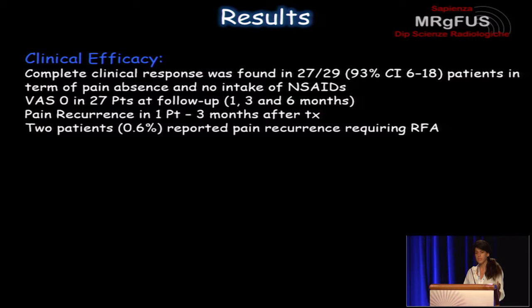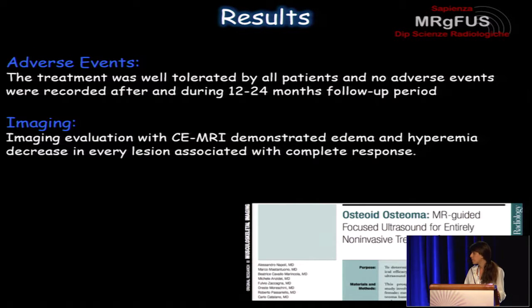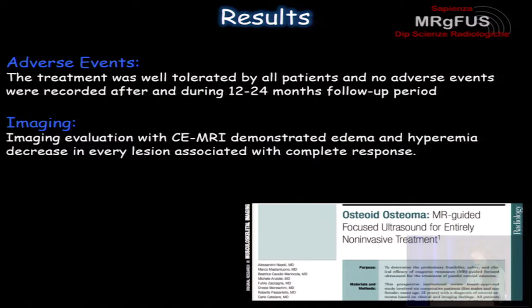Our results were as we were expecting them to be. We had a complete clinical response in 93% of the patients. There were no adverse events in the treatment itself or after the treatment. And regarding imaging, as we said before, checking with CT and MR, we saw that there was no edema or inflammatory response even a day after the treatment.